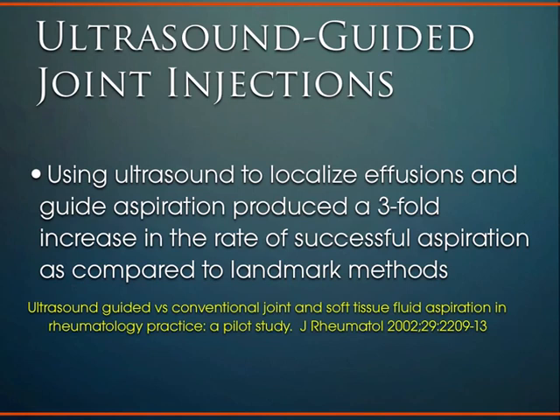But it's fairly blind, and you'll realize once you start using ultrasound guidance to do injections, and then have to go back and do blind injections, which I had to do after fellowship, it's a little unnerving. Now all of a sudden you can't see where the needle is or where you're going, and ultrasound is really very useful because it's real time.